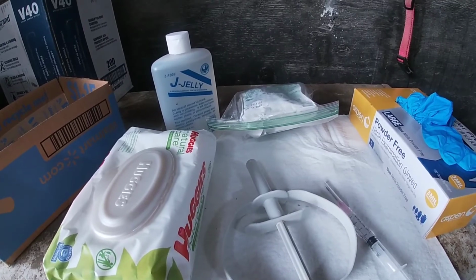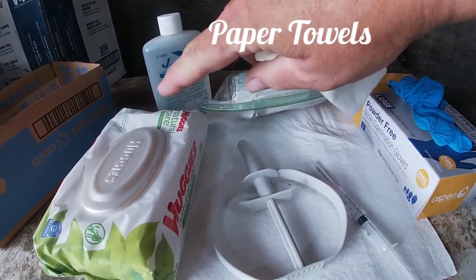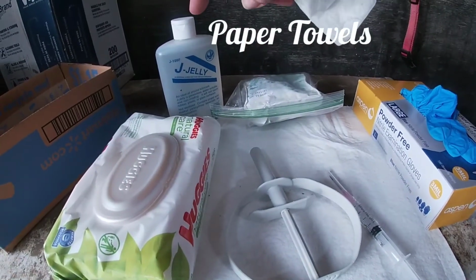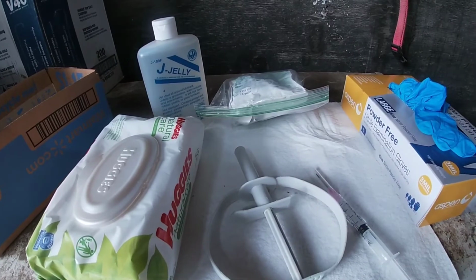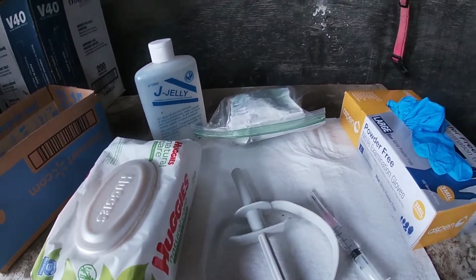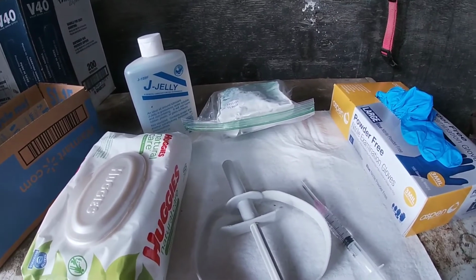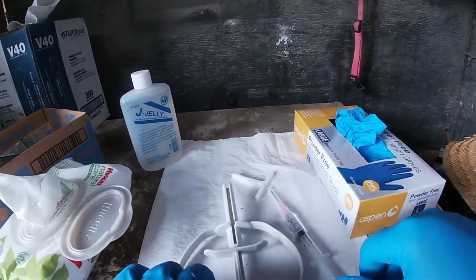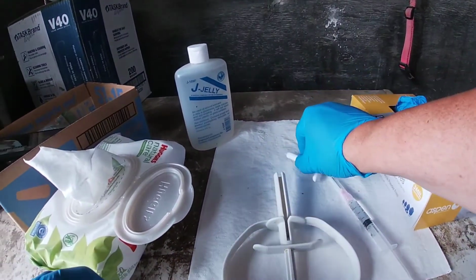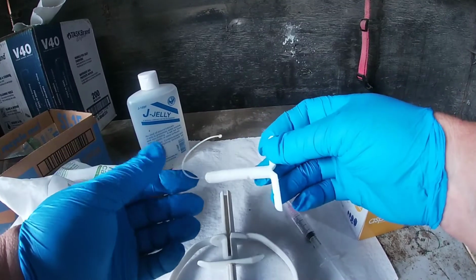Some other items that you probably should have available are baby wipes and some lubrication to put your CIDR in. So I'm going to go get the doe, and then I'm going to show you how the whole process works. Okay, so I am all gloved up and ready to go. This is what a CIDR looks like if you've never seen one before.